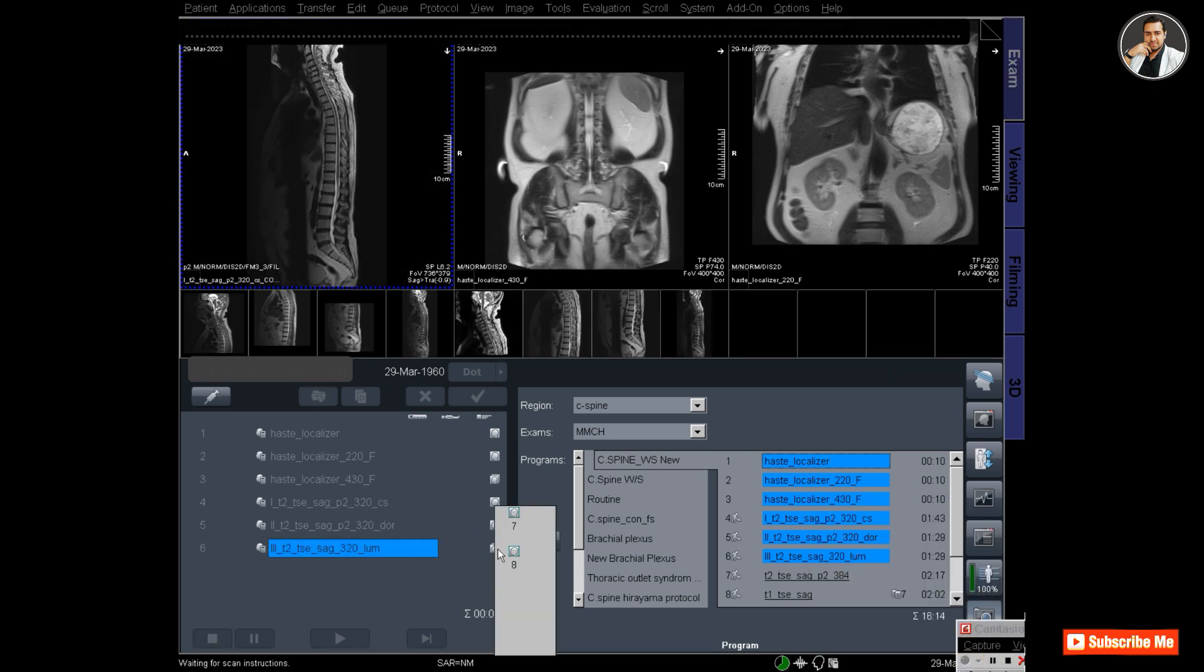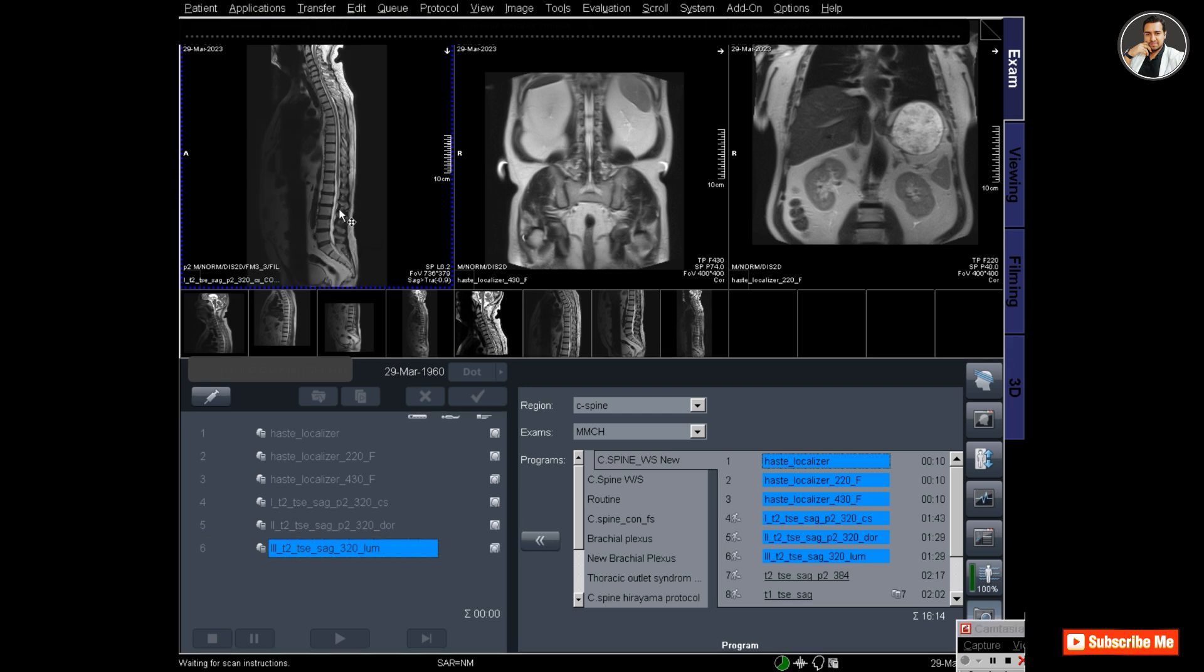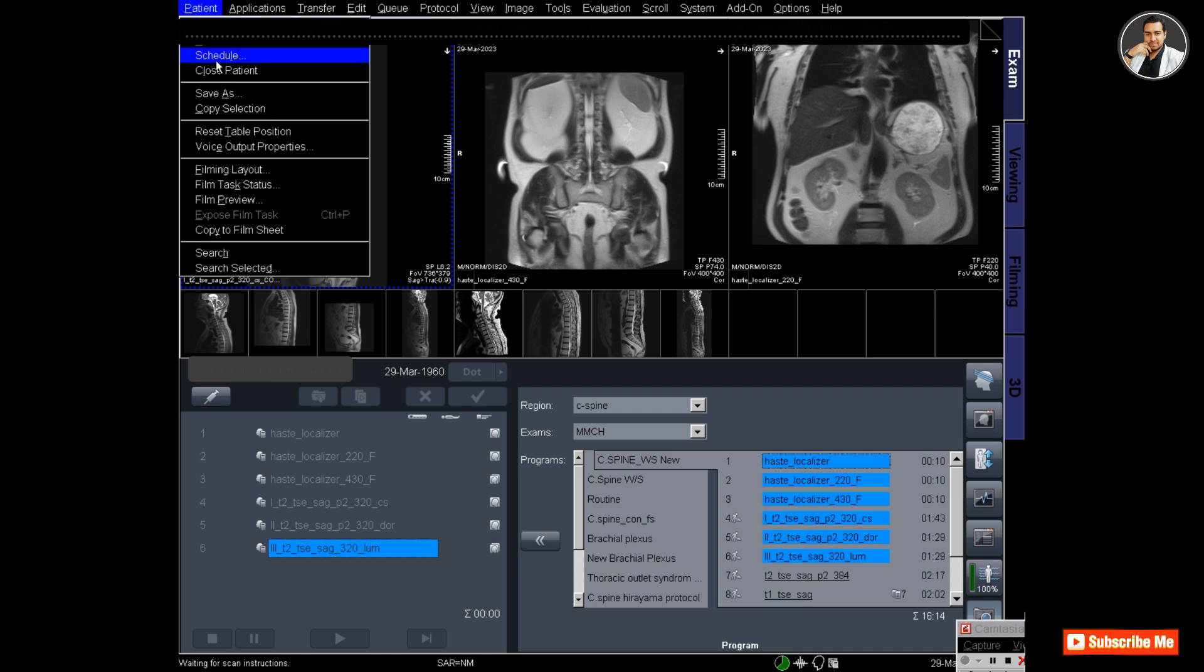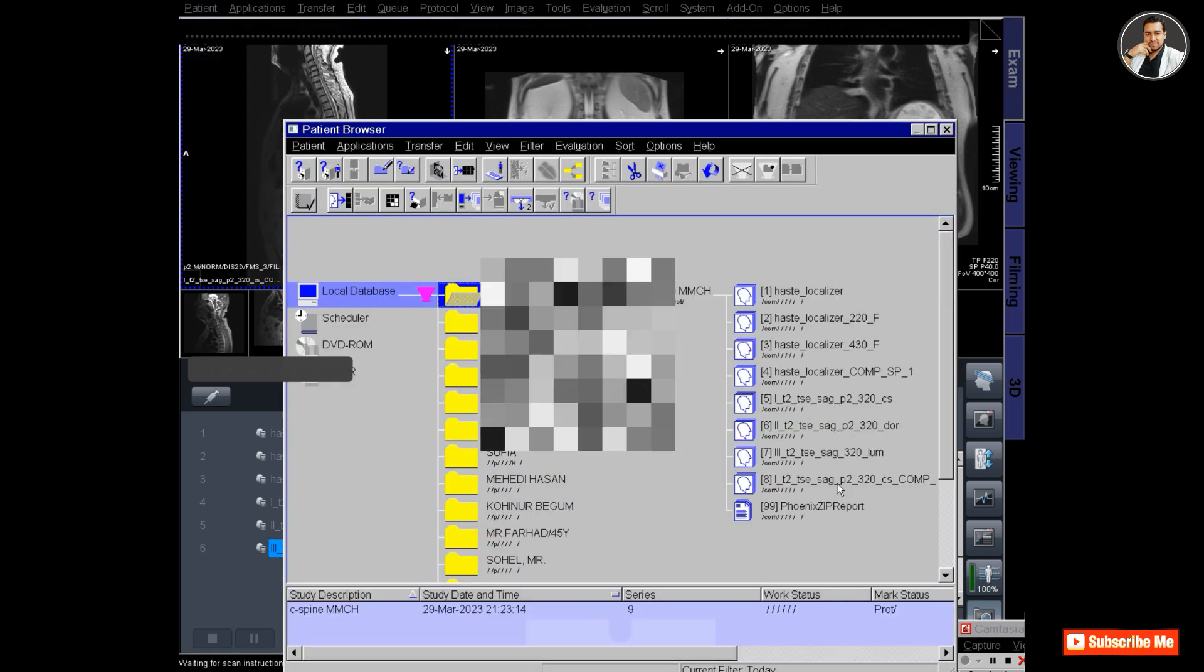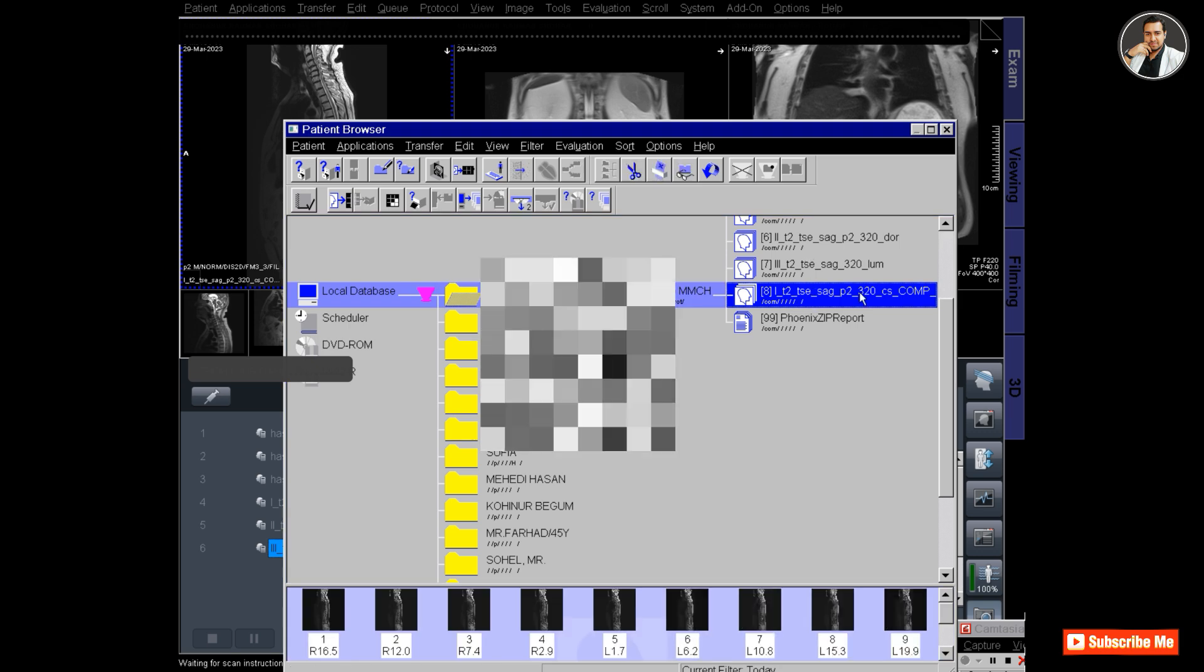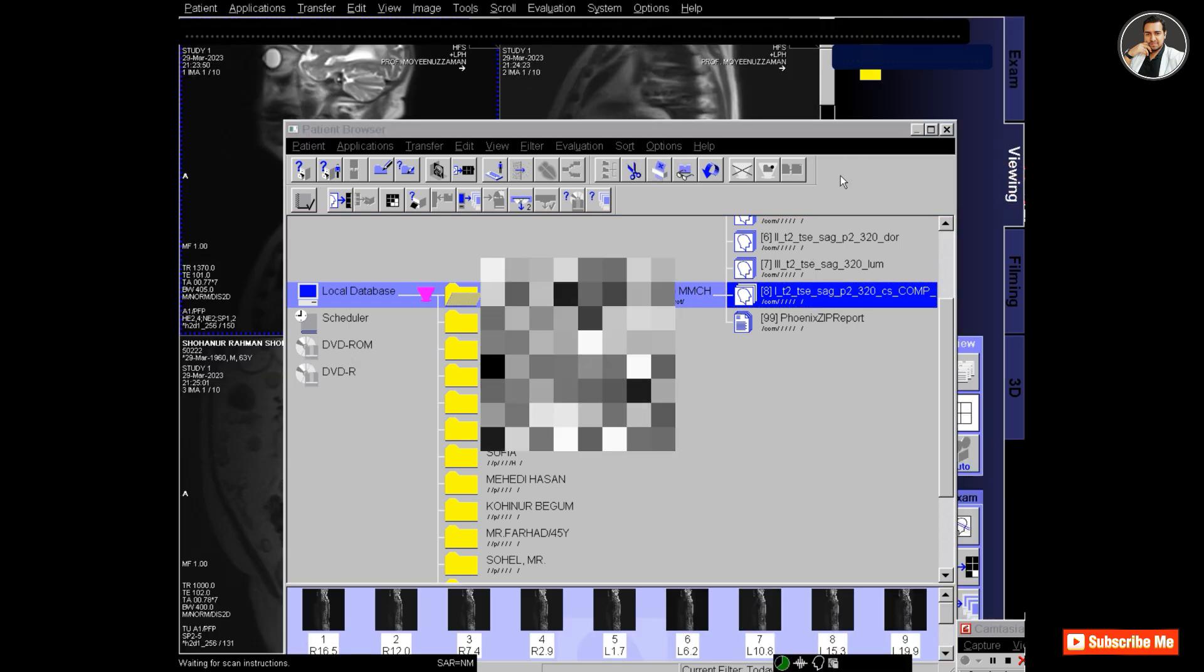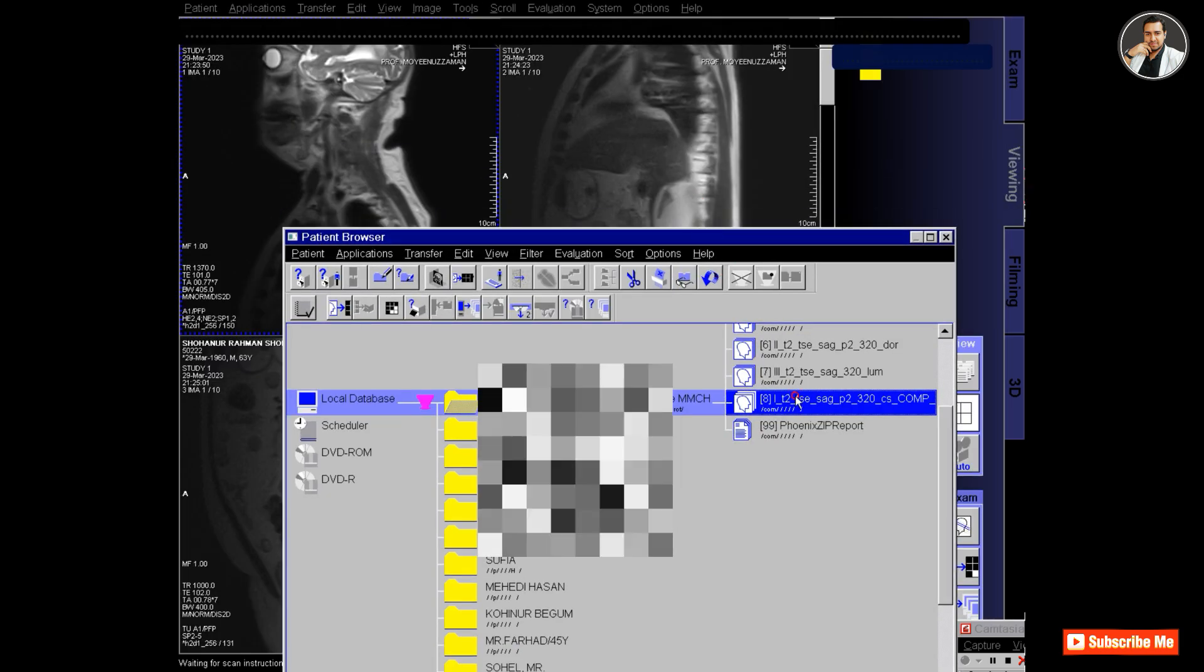Once all sequences have completed, you can see that my whole spine has appeared here. The software automatically composed the protocols to make a whole spine image. Let's check out the whole spine.